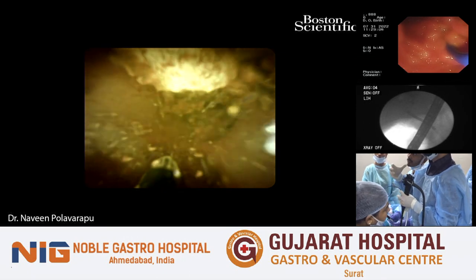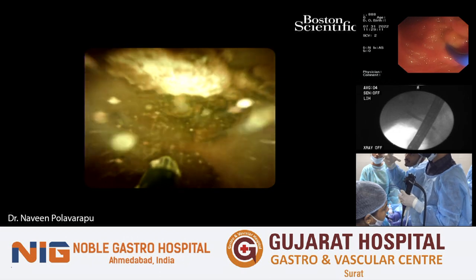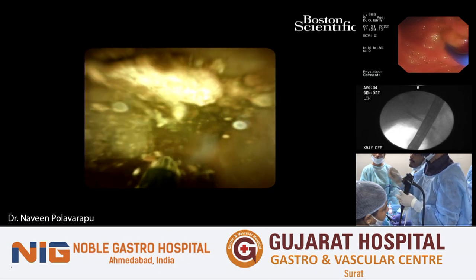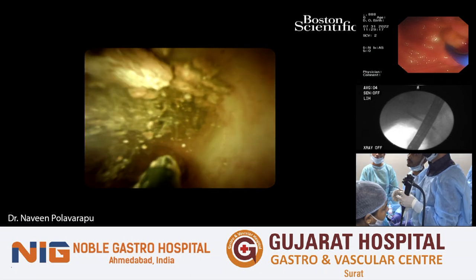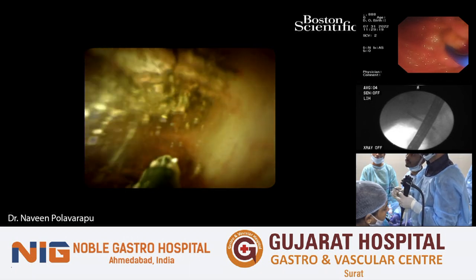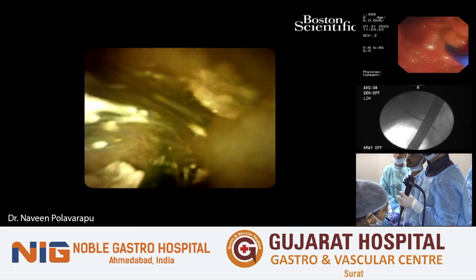It is going to be like a ball and cage. So if the cage is big enough and tight enough, then the ball will go and get stuck in the cage. So you can go with the SpyScope and then you can break it. That should not be a problem. You can break it as well as you can use a Spy basket. Spy basket as well, absolutely. We can use both of them.